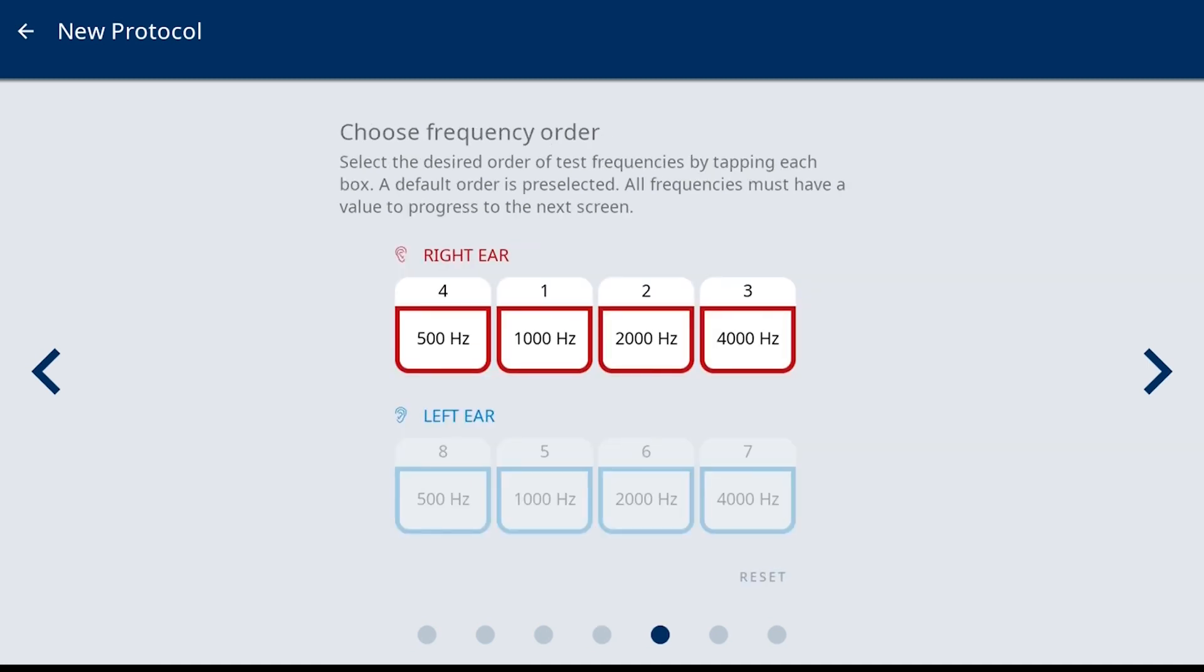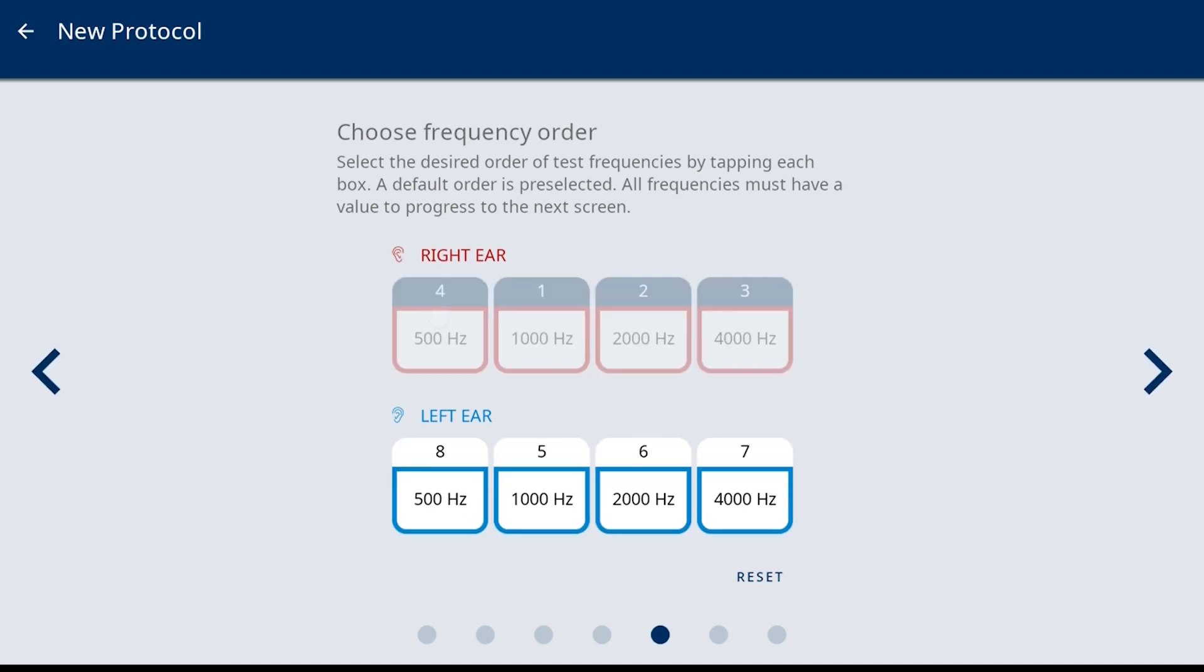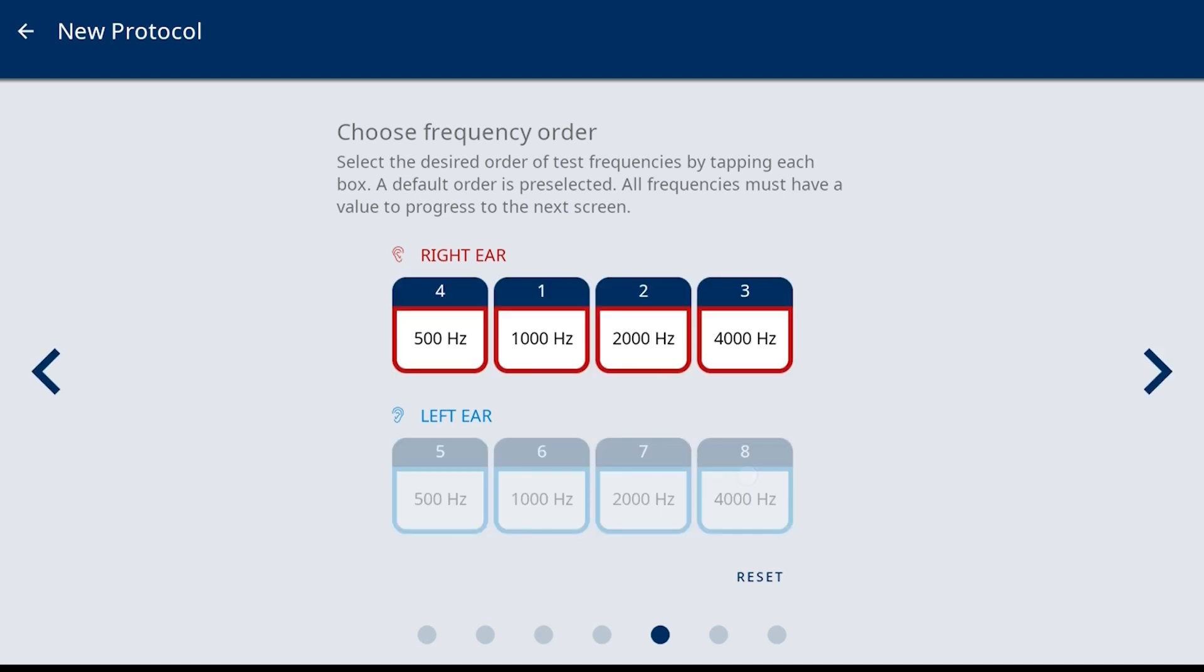Frequency order is the next protocol option. The EasyTone will automatically move to the next frequency upon scoring, so defining an order allows fewer button pushes during the test. To change the default order, just tap the first frequency and the order is cleared. For the audiometry protocol, the frequencies for the right ear must be selected before it transitions to the left ear.